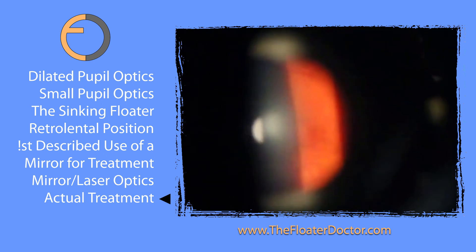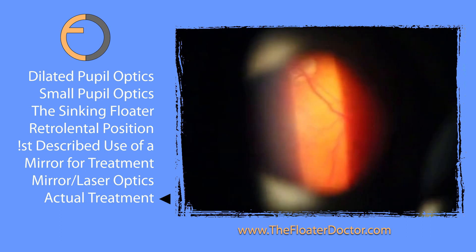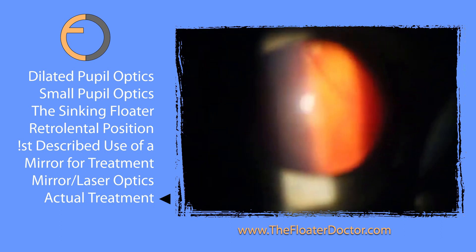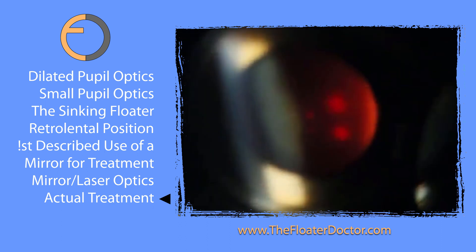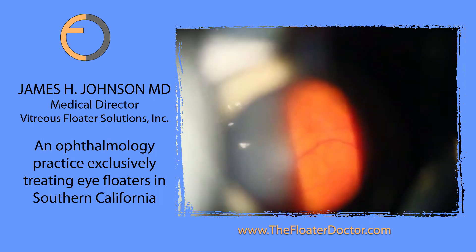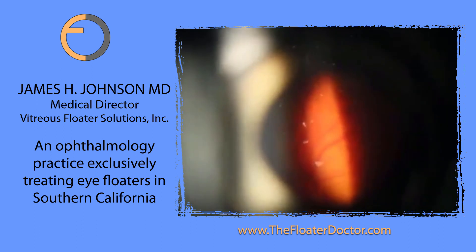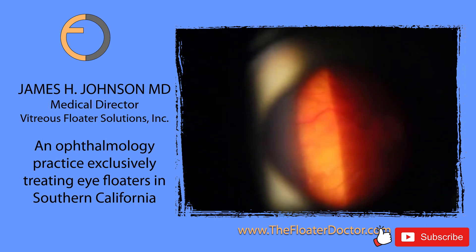We're back at the beginning of the third consecutive day of treatment. I'm using the Goldmann wide-angle lens again, doing some wide-angle scanning to see if there are any large chunks left behind. I had the person look left and right, and look down and back up — a maneuver that very consistently brought that large floater into place. We're not seeing that large floater anymore. Using unique maneuvers, particularly the mirrored angled shot of the Goldmann lens, I was able to use the energy of the YAG laser to break it up, move it into a more manageable and treatable position, and then go after it with conventional methods. As you can see, there really is no large chunk of floater left behind.